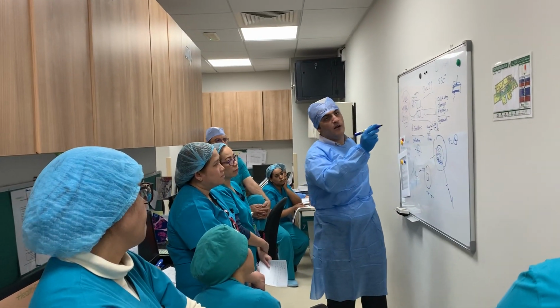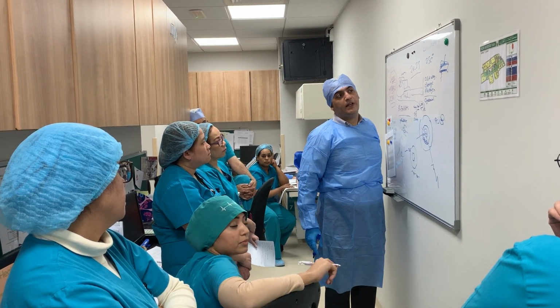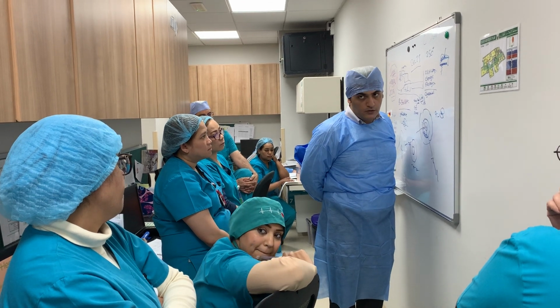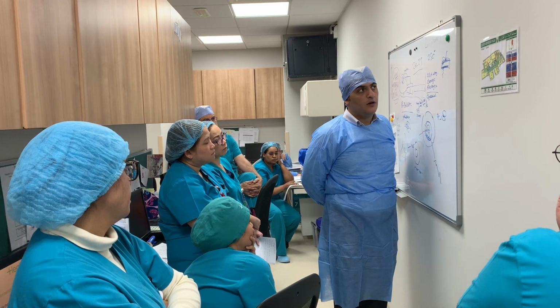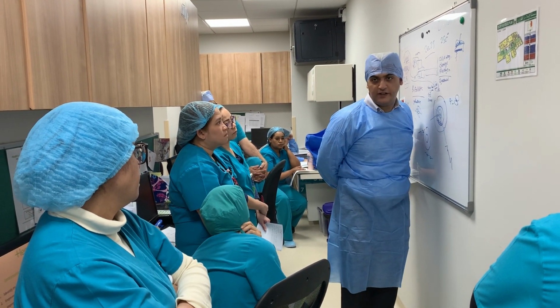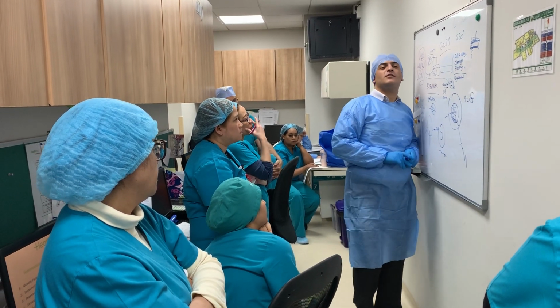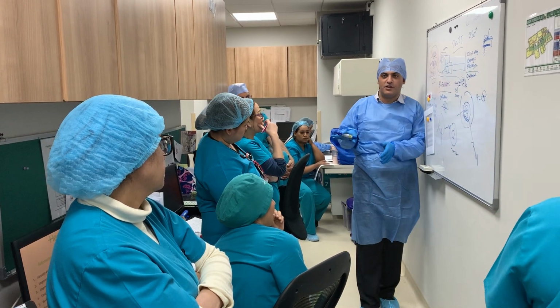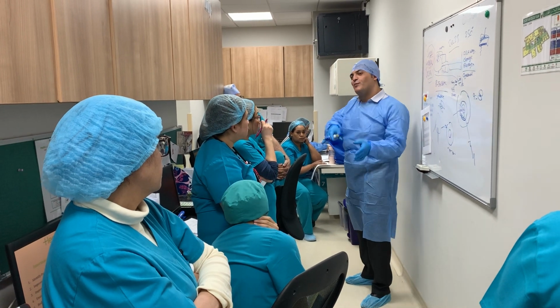So you take the good sperm from the surface. You can resuspend the decant for better results, with the same procedure. You can make it double in the same sample to give better results, or just one, of course. But you'll end up depleting more and more sperm, because the more sperm are exposed to any media or any condition, the more they suffer from damage. And this is why they will respond to you as well.